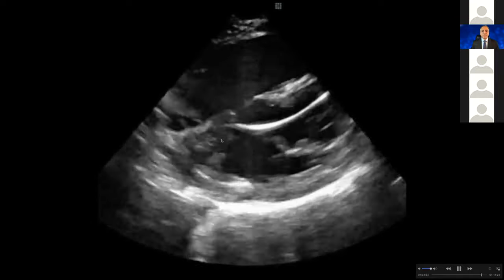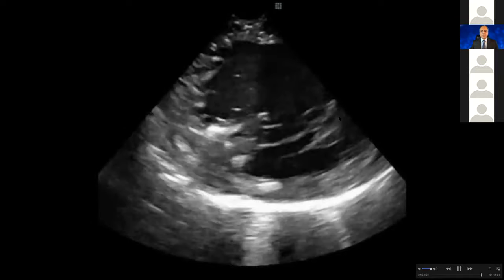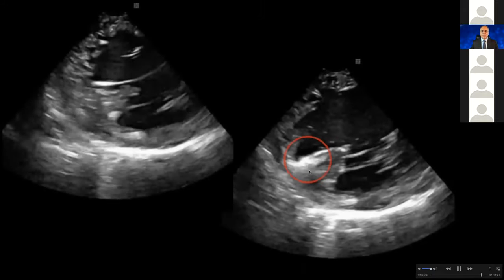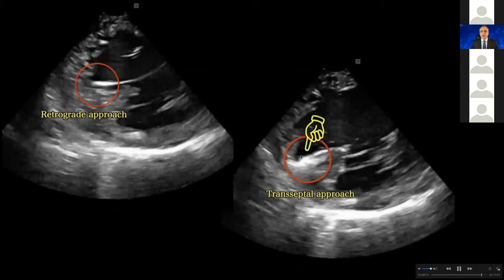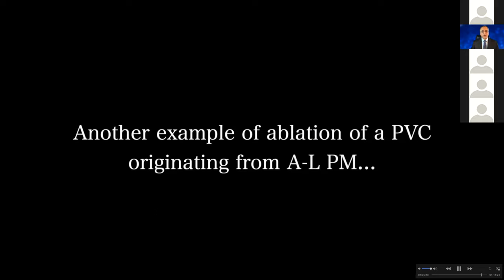Here you can see the very papillary muscle, but this time my ablation catheter went through the mitral valve. With the transeptal approach, I'm sitting on that very tissue, as opposed to the retrograde approach — you can see how snug the tissue is here, as opposed to the distance between the catheter when we went retrograde.